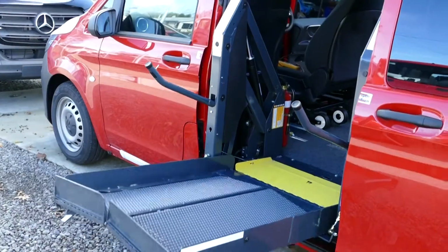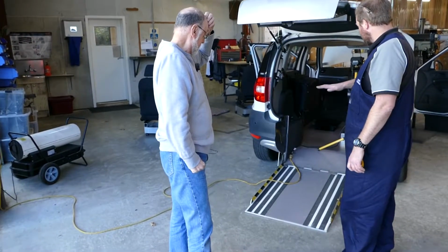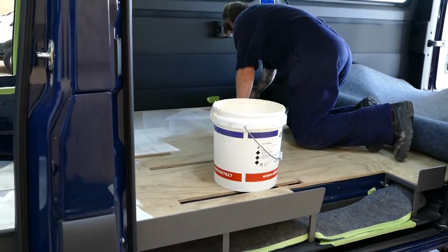You'd break it down into those that drive and those that travel as passengers. So for those that travel as passengers, then the modifications will be the means of accessing the vehicle, which is primarily a hoist. Sometimes it's a ramp, but more often than not it's a hoist. You've got to put a level floor in, so that the rear of all vans are all corrugated for strength. So you've got to put a wooden floor in so that the wheelchair will run to the correct position. There will be the restraint system that holds it down, a seat belt to hold the person in there as well.